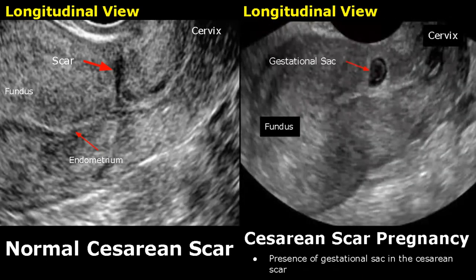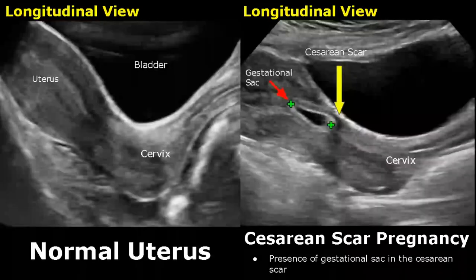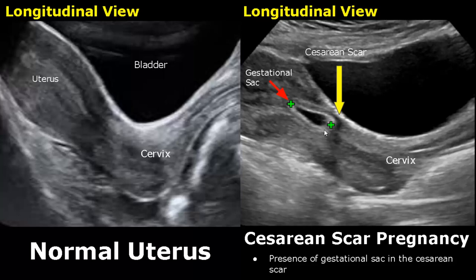Caesarean scar pregnancy is very rare. It is a type of ectopic pregnancy, but it is not an accurate term because the gestational sac is still implanted within the uterus. The gestational sac is present in the caesarean scar. Here is another image of a caesarean scar pregnancy — we can see the embryo very clearly here. This is a transabdominal image of a caesarean scar pregnancy; the gestational sac is seen within the caesarean scar.